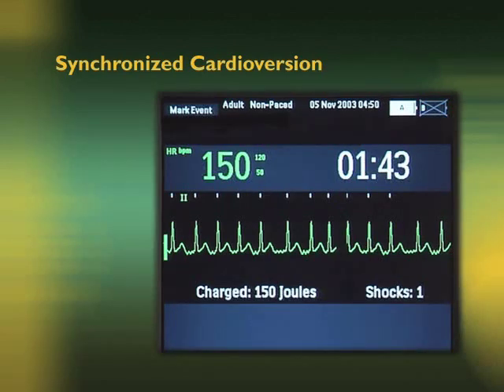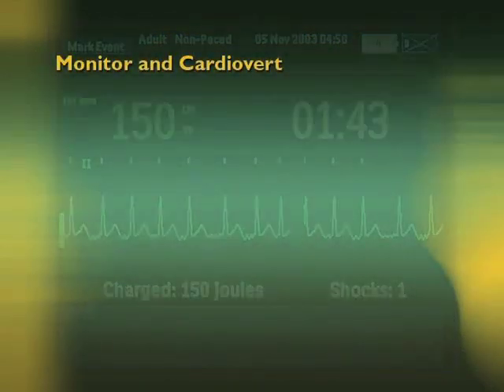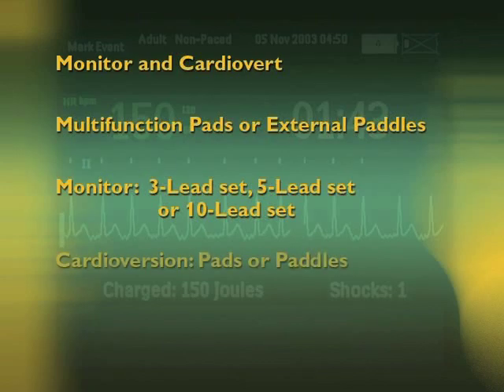With synchronized cardioversion, you deliver a shock synchronized to the R-wave of the ECG being monitored. You can monitor and perform synchronized cardioversion through the multifunction electrode pads or external paddles. Or you may choose to monitor the ECG through monitoring electrodes connected to a 3, 5, or 10 lead ECG cable, with the energy delivered through the pads or paddles.